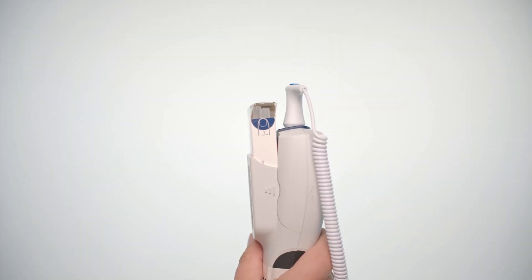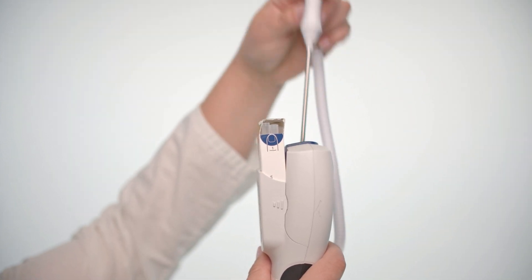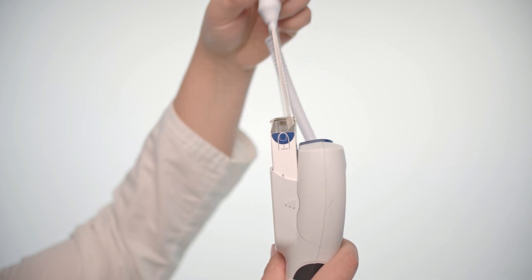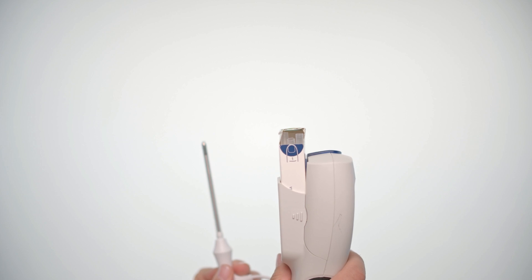Attach the blue oral probe stem to the thermometer. Slide a disposable cover over the temperature probe. Ask Fred to open his mouth and insert the thermometer into one of Fred's posterior sublingual pockets at the base of his tongue, not in front of it. Ask Fred to keep his lips closed. Wait 20 to 30 seconds or until the thermometer chimes.